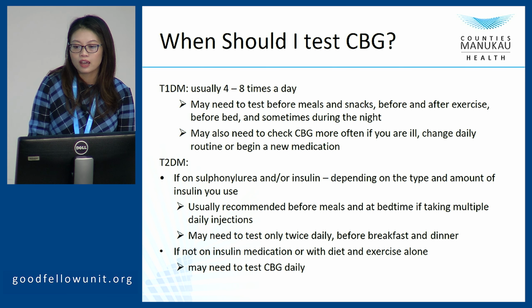For type 2 diabetes patients on sulfonylurea or insulin, it depends on the type and amount of insulin they use. Usually we recommend before meals and also at bedtime if taking multiple daily injections, or maybe just check twice a day, before breakfast and dinner. If patients are on diet control or not on any insulin medication, they can check their blood sugar level every day.